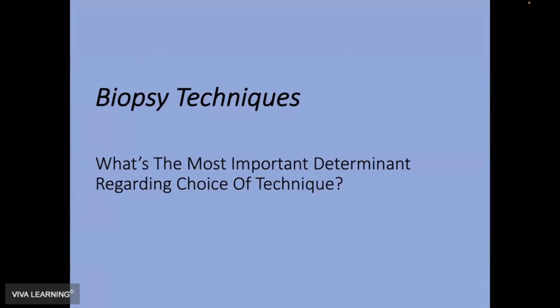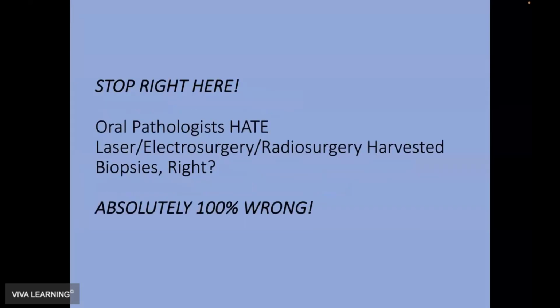Biopsy techniques. What's the most important determinant regarding the choice of technique? Should I use laser? Should I use electrosurgery? Should I use radiosurgery? Should I use cold steel? Should I use a punch? What's the most important determinant of which technique I'm going to use? Stop right here for a minute.